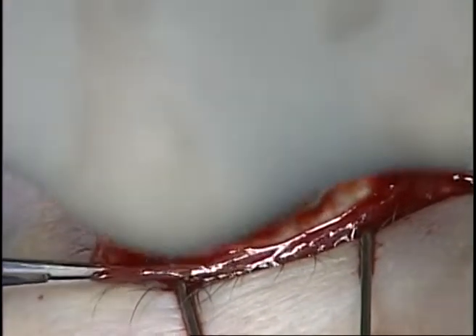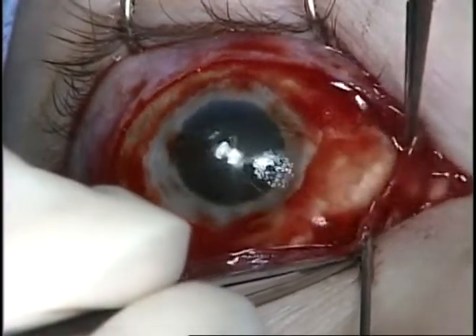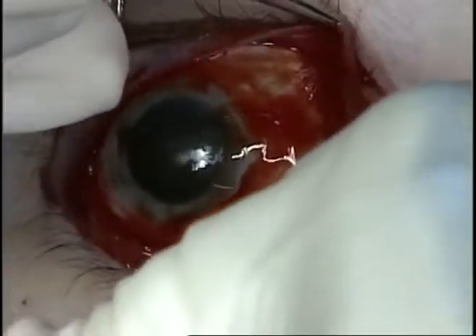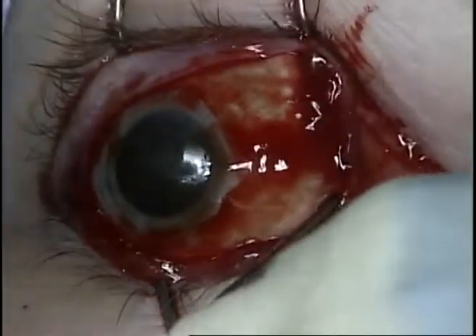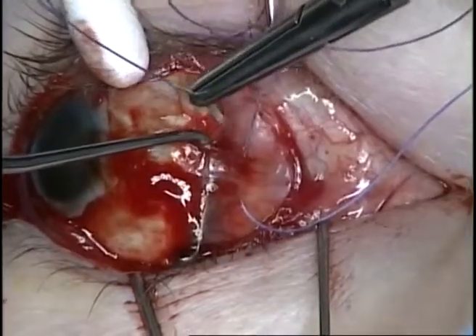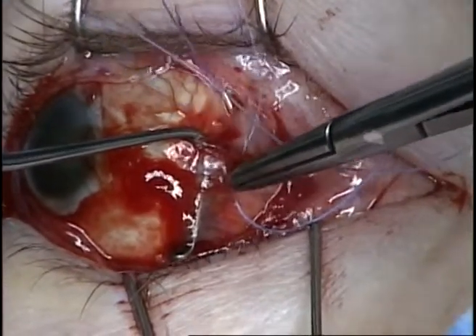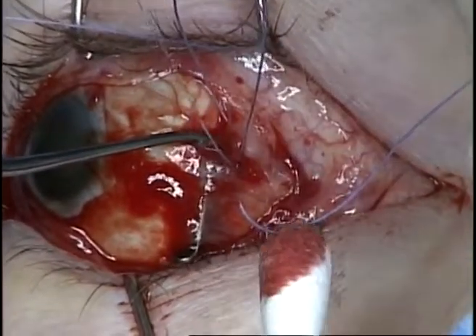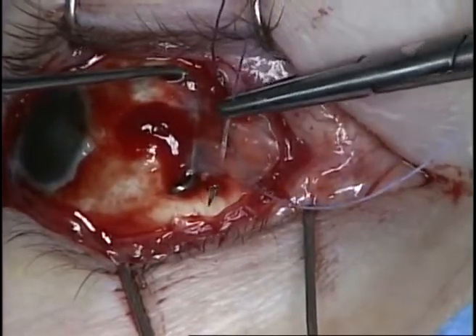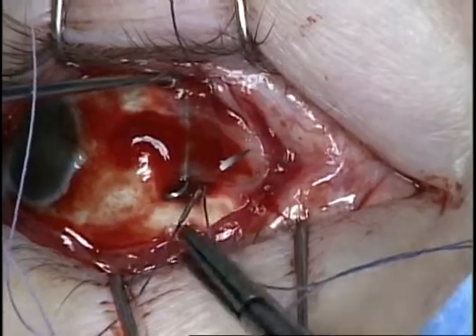The medial rectus is then hooked with a von Graefe muscle hook and transferred to a green hook. The muscle is then tagged with a double-armed 5-0 Vicryl suture on a spatula needle, placed in a locking fashion. The medial rectus is then disinserted from the globe with a stump remaining for future traction suture.